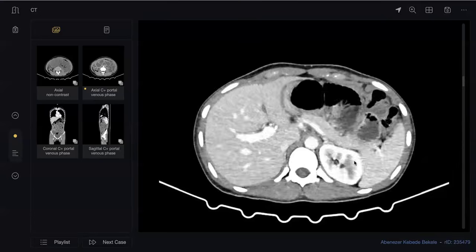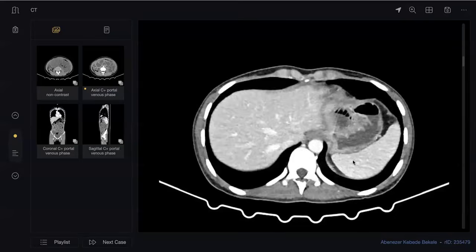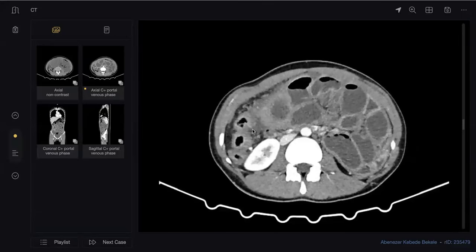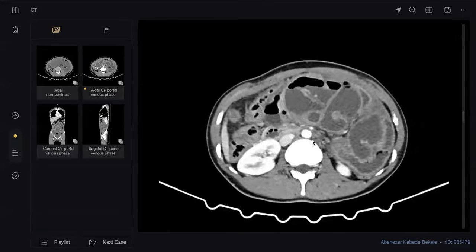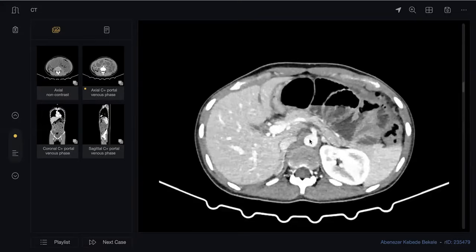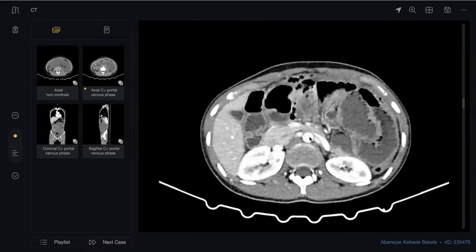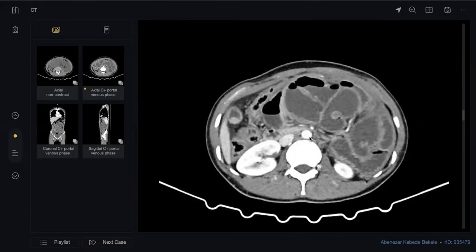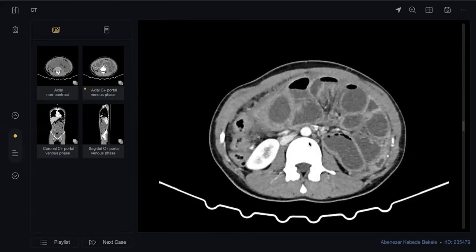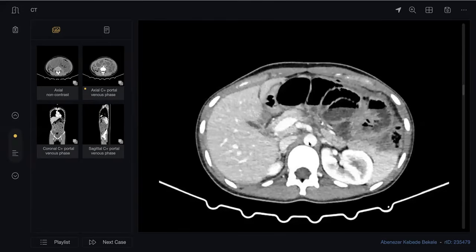Okay, I'm trying to look out. So if you're suspecting ischemia, what structures do you look at? Yeah, I will review the vessels first for that. Okay, so I'm reviewing the vessels. As these are the small bowels, I will give attention to the celiac and SMA. Celiac appears to be normal, now SMA. I couldn't appreciate any obvious thrombus. Coronal and sagittal will be more helpful to comment.